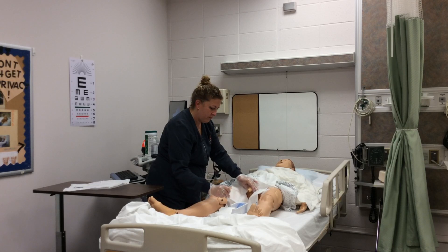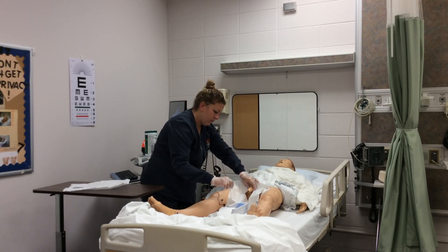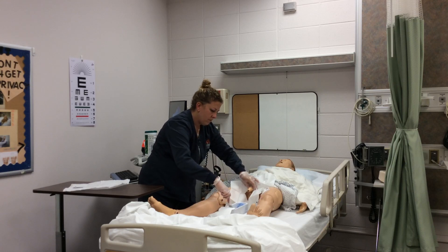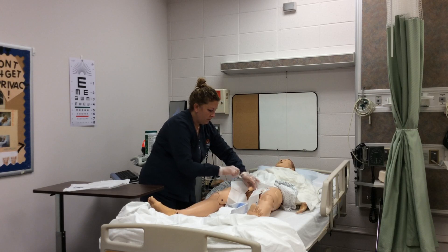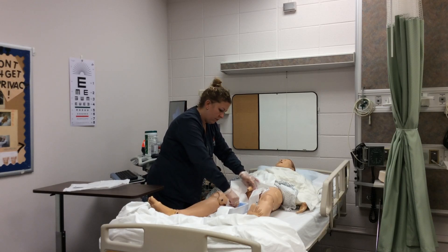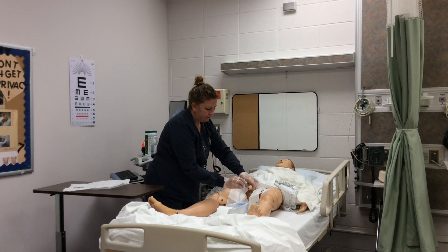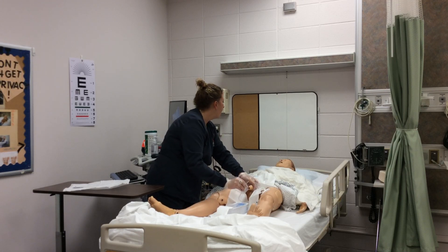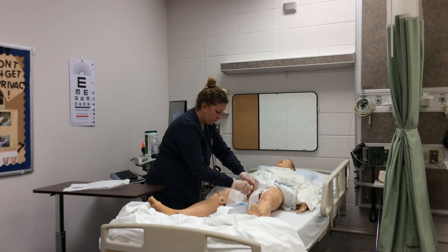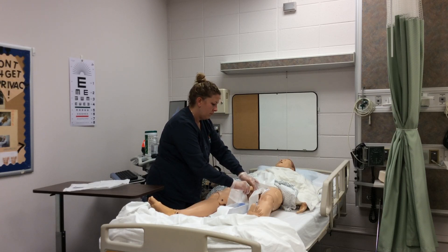She cleanses the urethral meatus and head of the penis in a circular motion from the meatus outward using each of the three antiseptic swabs, retracting the foreskin if necessary. She disposes of the swabs without crossing the sterile field. For the male, she holds the penis with her non-dominant hand at a 90-degree angle from the body, instructs the patient to bear down, then inserts the catheter, advancing until urine is seen. She confirms: 'I see urine,' and continues to support the penis while holding the catheter with her non-dominant hand.